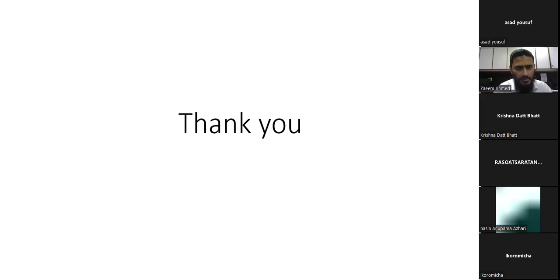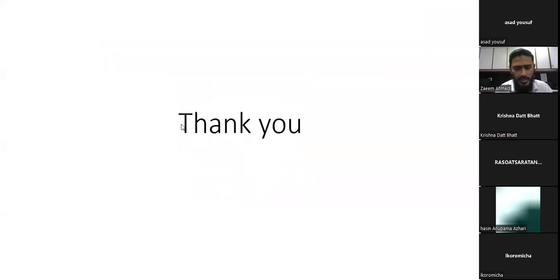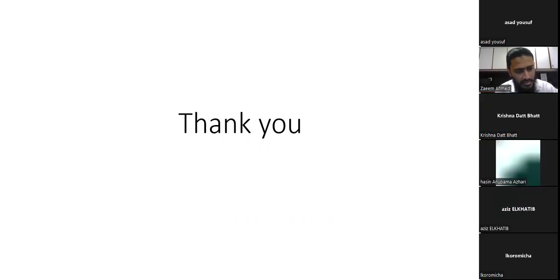Okay, so the project we did for xerostomia, for example, let me go to the slides. We had patient data sets of already treated patients, and for these patients we have CT scans. Once we extracted radiomic features from the CT scans, which were already taken for planning and follow-up purposes, we found some radiomic features which correspond to xerostomia.